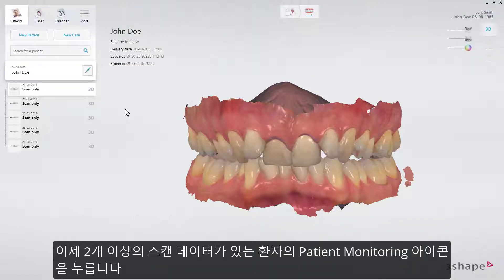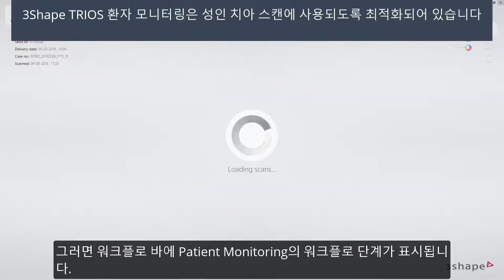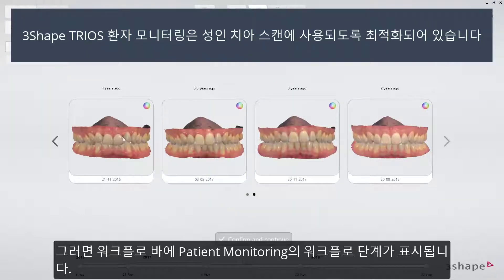Now that we have a patient with two or more scans, simply press the Patient Monitoring icon and the workflow bar will expand to show the workflow steps of Patient Monitoring.